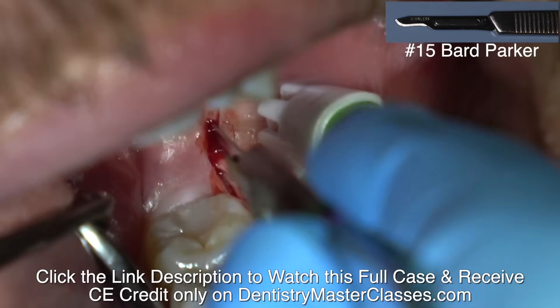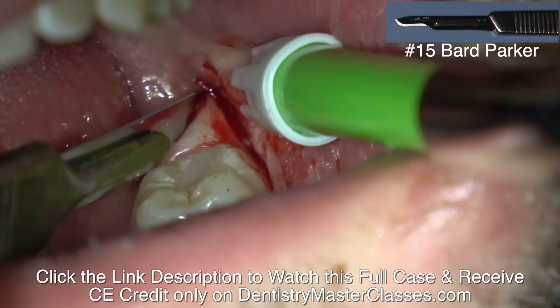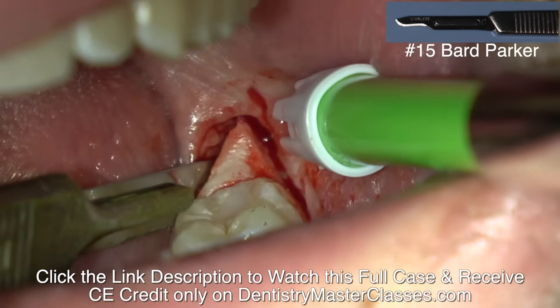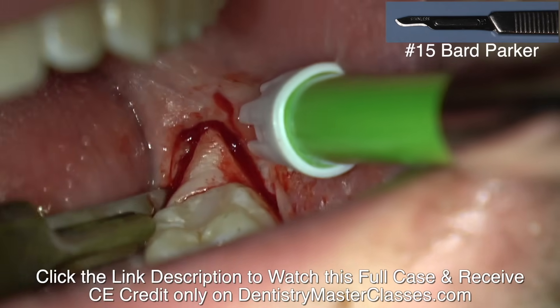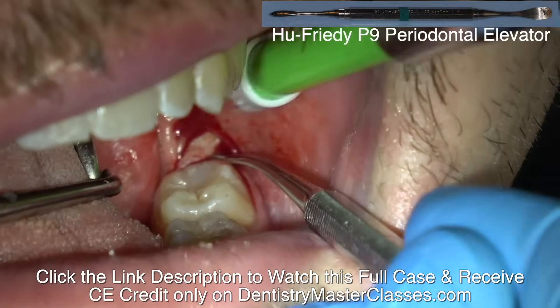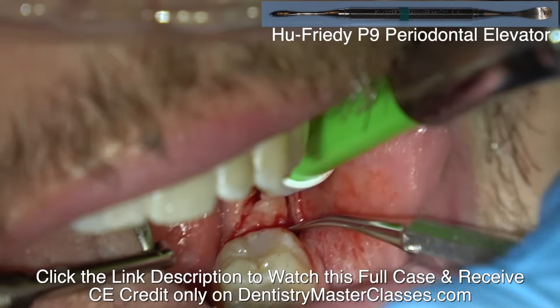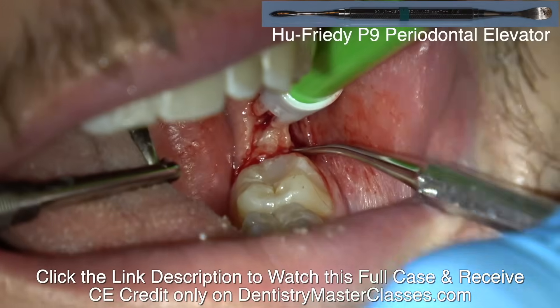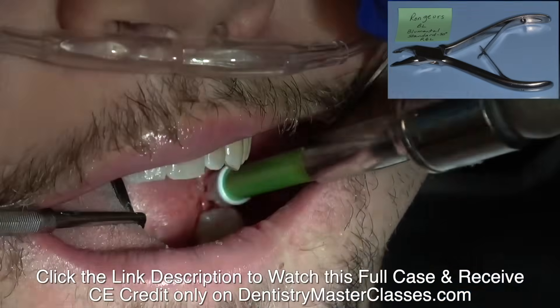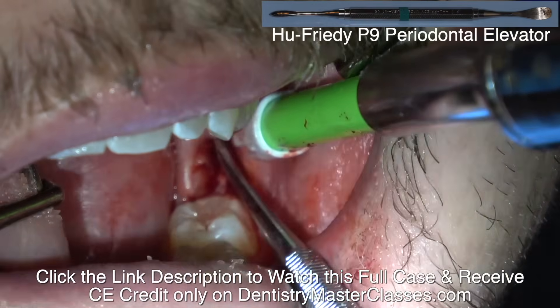So I'm making my cut along the ramus. Don't make your cut past the lingual of the second molar — you don't want to damage the lingual nerve. So keep it on the ramus. Cut here, cut here, and then I'm going to cut through here. And that's called a distal wedge. So when you remove the tooth, you've got a space and more tissue than you need, and that allows you to close the flap up completely.